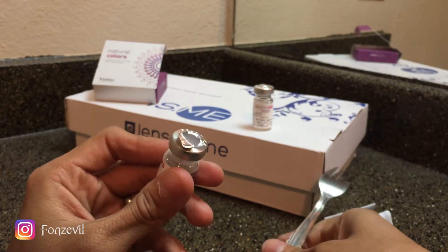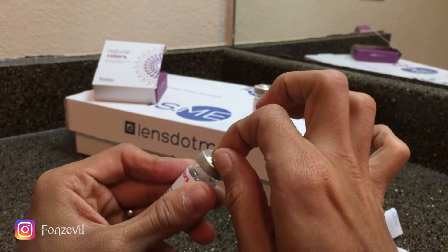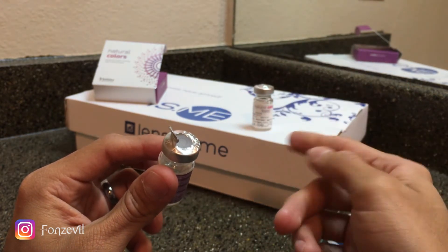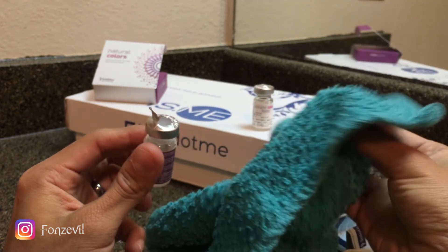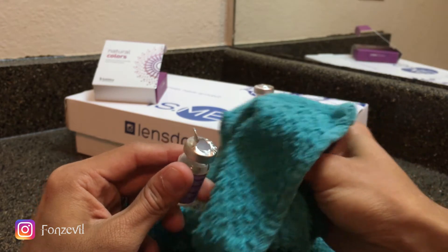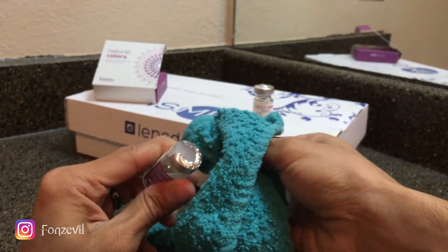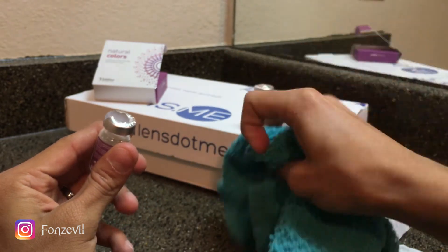I know a lot of you guys are going to want to just get it and pull it, and you guys have the option to do that, but that's still not safe. So what I recommend is getting a little rag — a kitchen rag, bathroom rag, a towel — and then just kind of pull it off.